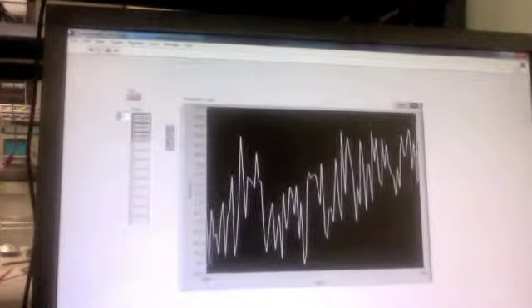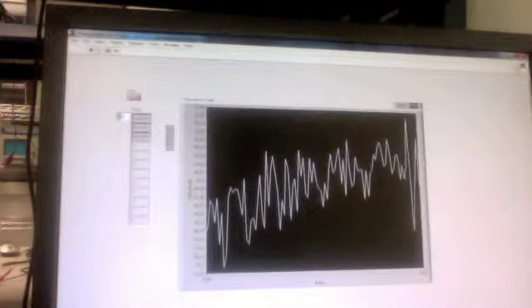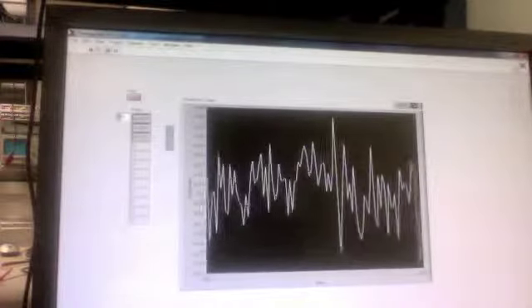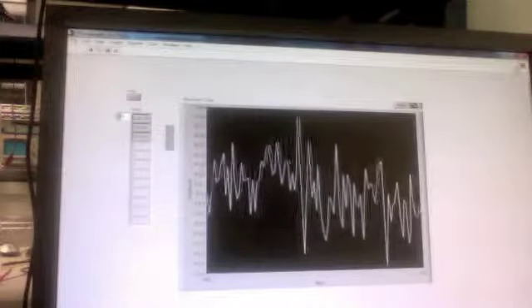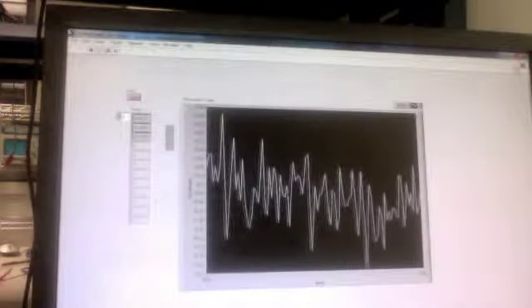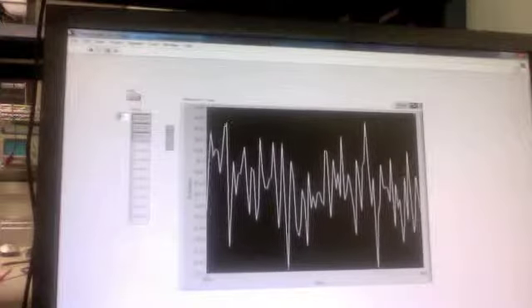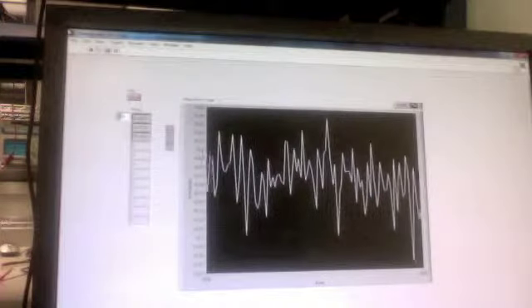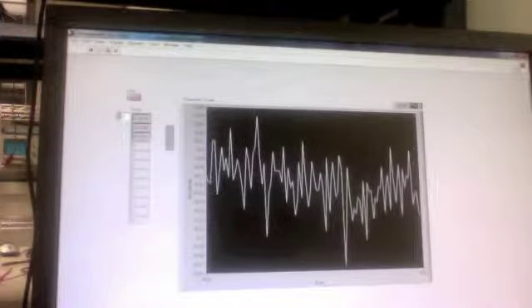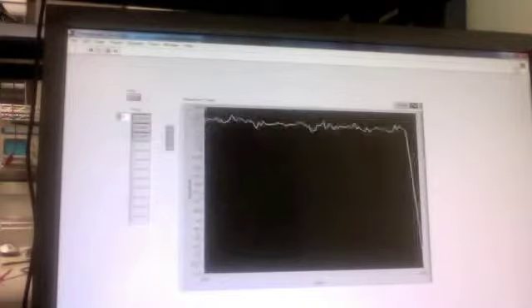Our research showed that seizures occur in a range of about 8 to 42 Hertz, and seizures are about 10 millivolts, whereas non-seizures are lower frequency or much higher frequency, and they're about 5 millivolts. So ideally, if we input a sine wave within the seizure frequency and amplitude range, the device will detect it as a seizure and start cooling. So let's do that.